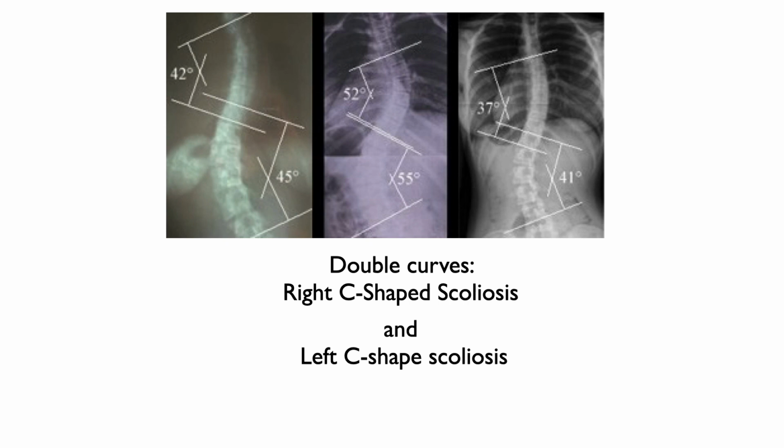Well, let's talk about double curves. Now we can call these ones a dextrothoracic, meaning right thorax, and levolumbar, meaning left lumbar. But most commonly, this type of curve is called a reverse S-shaped curve. So when you look at someone from behind, this is the shape they will have. They will have a slight rib hump on their upper right back and a slight thickening on their lower left back. And you may even see the spine in this reverse S shape.